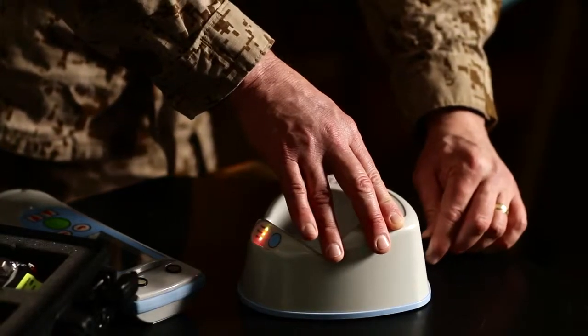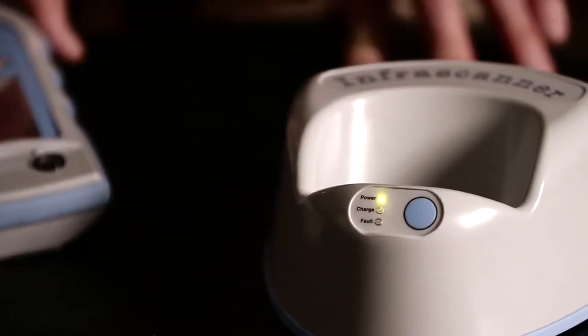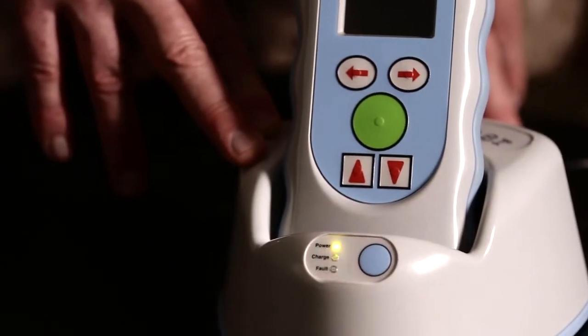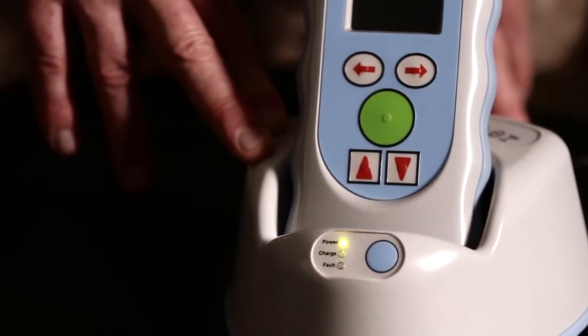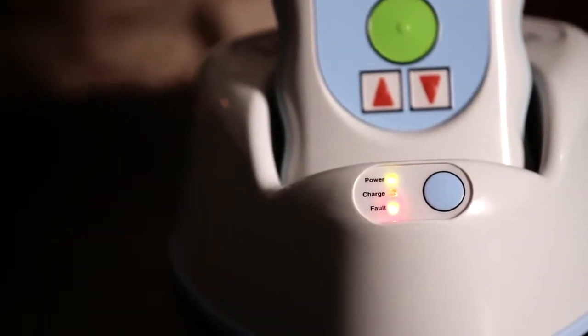If you're in a clinical or hospital environment with a power source, you can use the rechargeable batteries. Once you plug in the device, it's going to blink. For ten seconds you may insert the InfraScanner into the cradle. The orange lamp will blink to indicate the InfraScanner is charging. If disposable batteries are in the InfraScanner, the red fault light will come on.